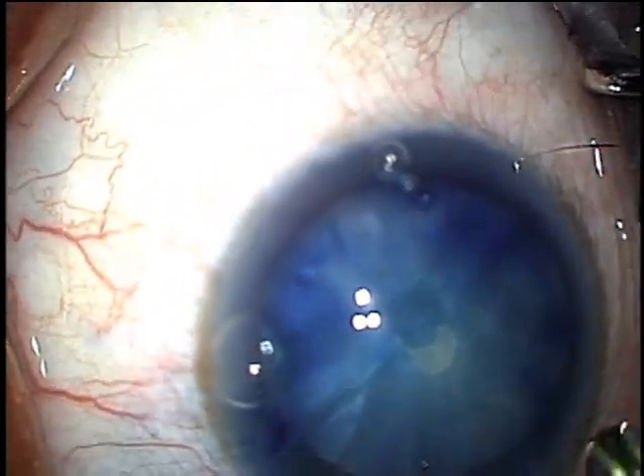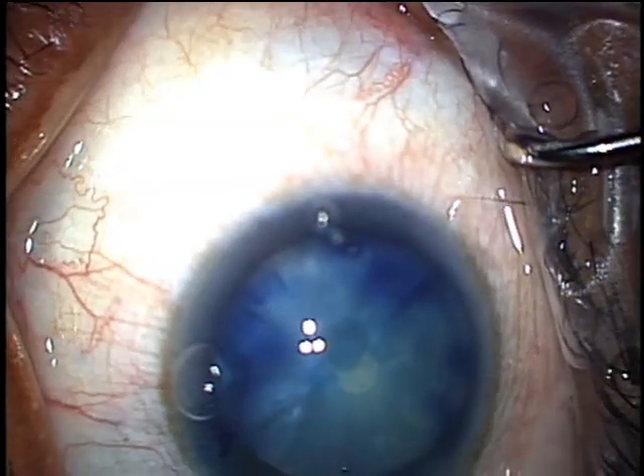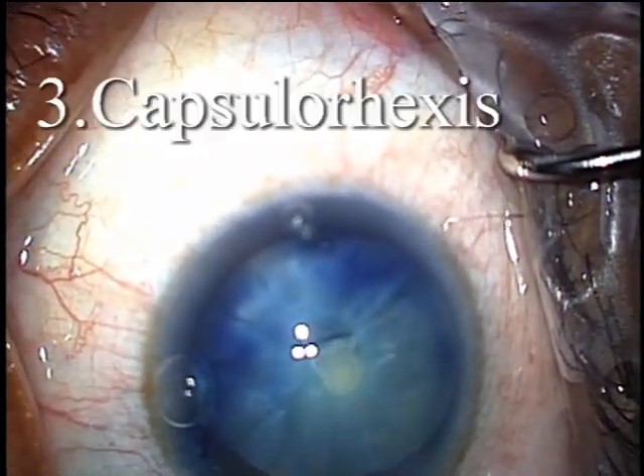Now bring your tip out. Viscoelastic will stay in and keep the anterior chamber formed. And now you have a nice rent, which will not proceed to the Argentinian flag sign.